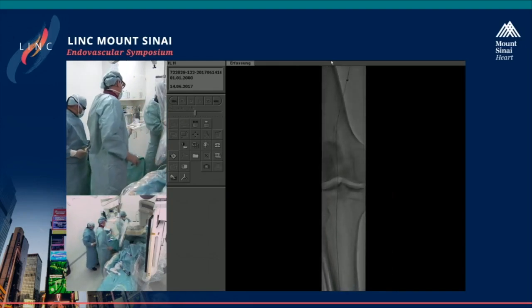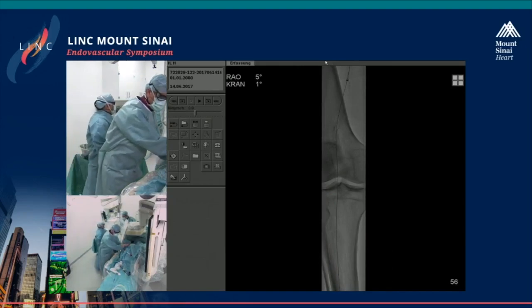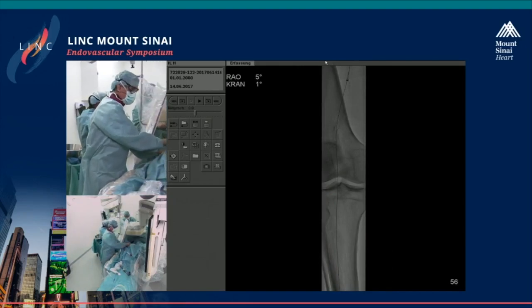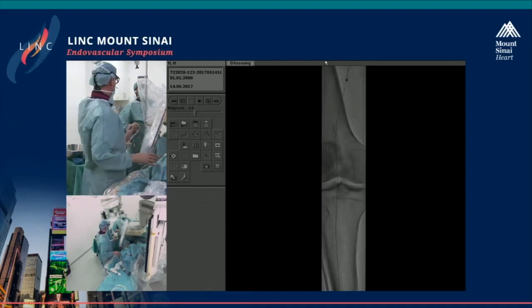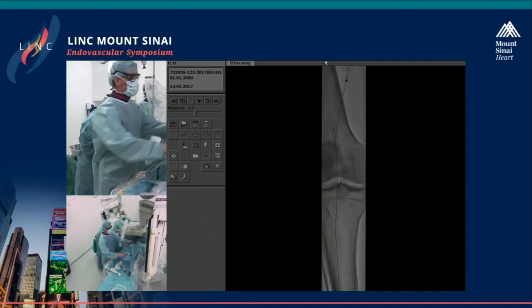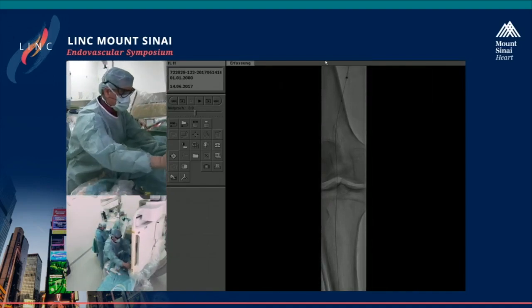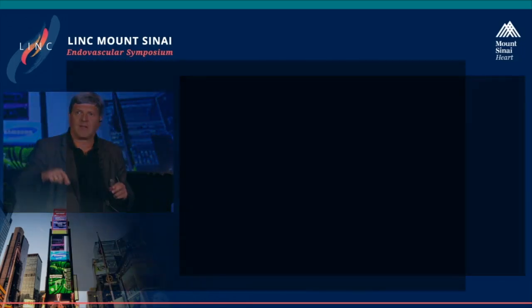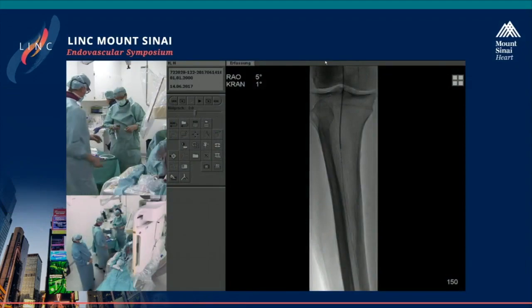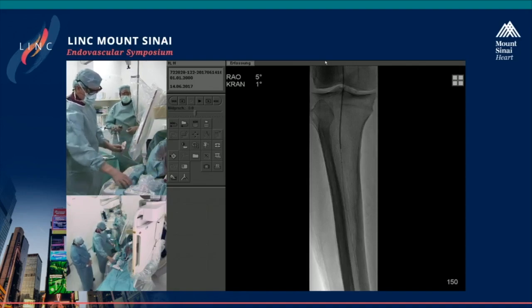I mean, would it be possible that we put you just on the side screen now for the balloon dilatation so that we have enough time to see the bullfrog procedure? Yes. Okay. Good idea. Okay, so let's do that. I would then ask George Adams again. So maybe we can just go back because that's more or less identical technique which we have just seen. So, Andre, we are back with you.